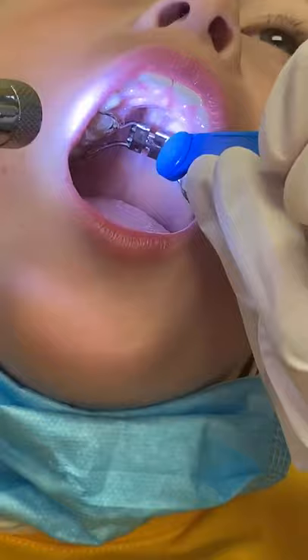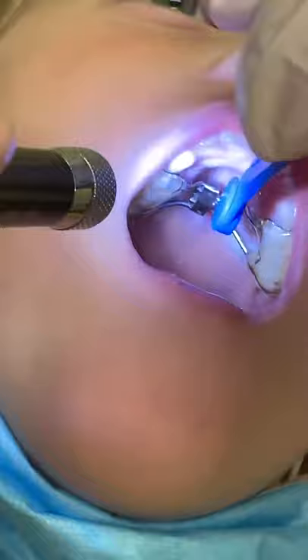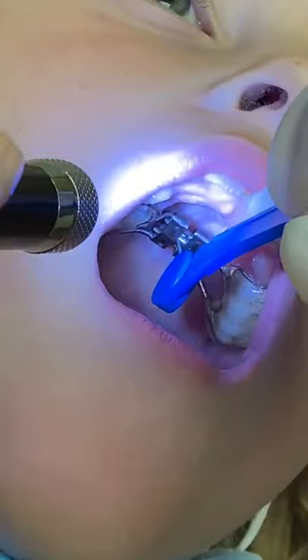Once we have our key all the way down, line this up. We're going to go from this top full circle and make sure it goes all the way in. Once it's in your tub you'll be able to wiggle it and it won't go anywhere. Then we're going to guide this back, pushing it all the way back going towards the back of the throat.